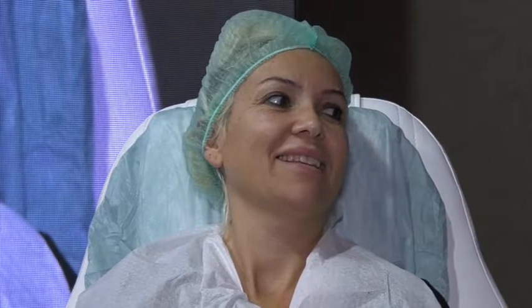Saeed, glad you're here. The only question that we always get from the patients is how long the thread is going to stay. We answered that it's going to stay 1 year almost, plus or minus. Is it still true? It's 100% true. Don't promise more than this. That's the reality. I don't know how your marketing is, or how the center you are working at advertises, but the reality is it is 1 year plus or minus 10%.